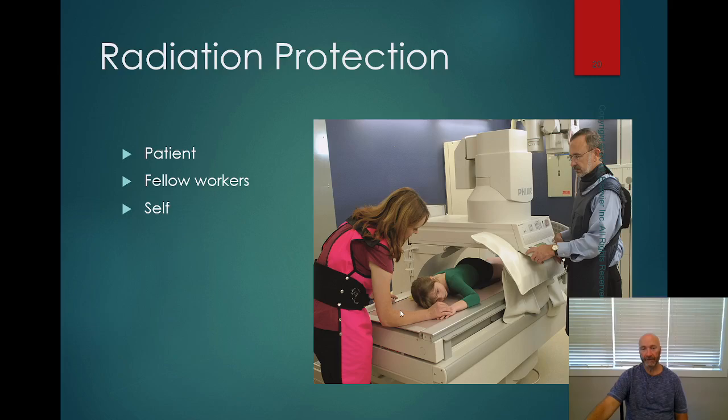So the less time she spends right here absorbing all that dose, the better, and the patient really is the source of our dose. The x-ray beam is coming up through the patient, interacting with the patient. She's getting scattered radiation off the patient. So spend as little time here as possible. So that's time. Increase the distance as much as possible.